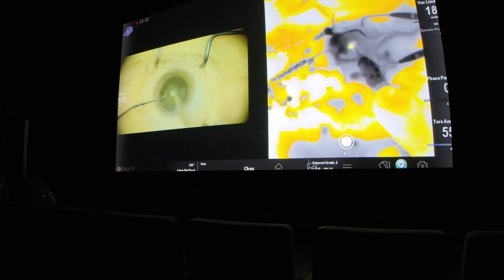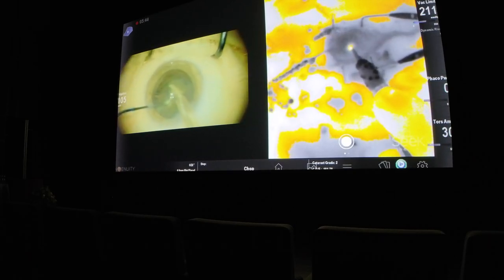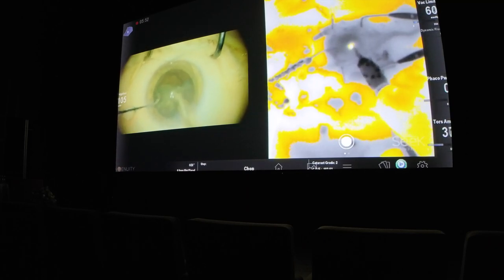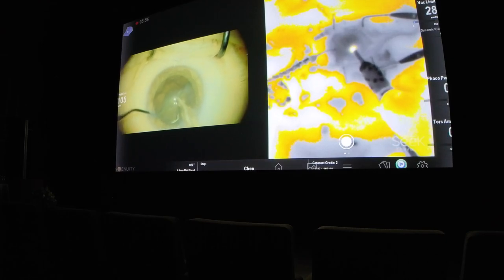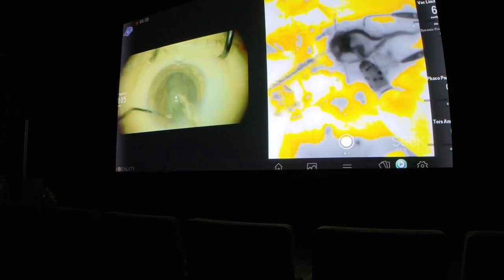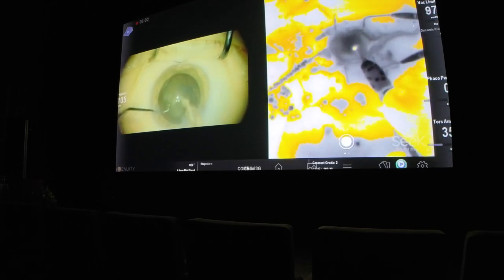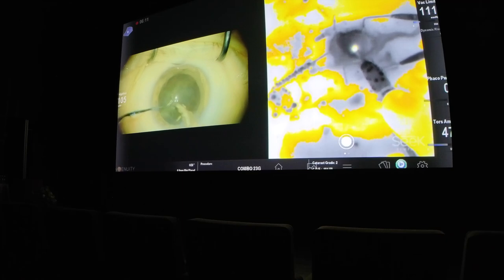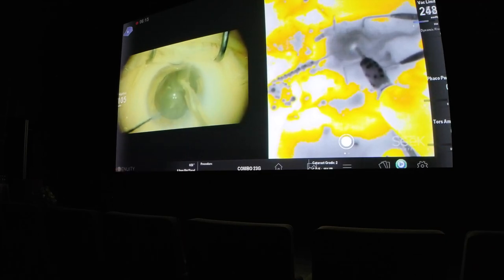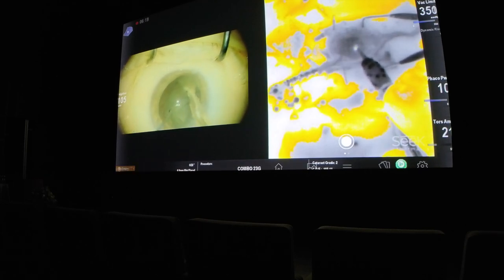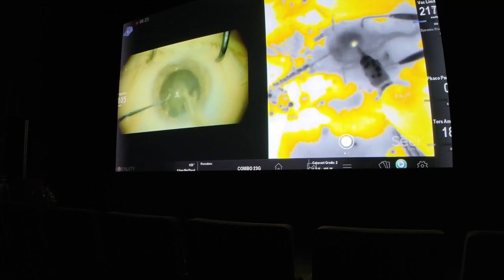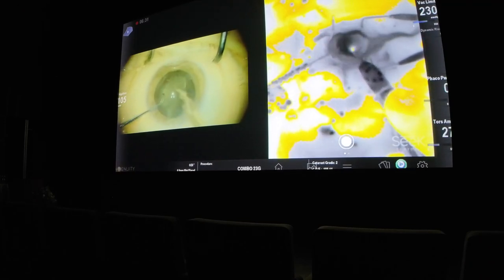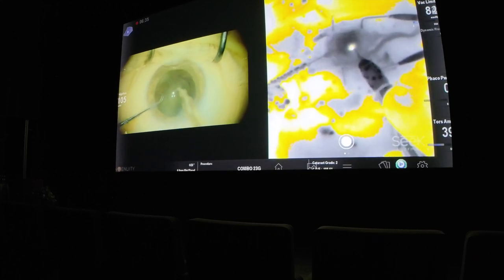This is another option showing how the picture-in-picture capability of Ingenuity might even increase our scientific research. On the right side of the image is a thermal camera attached to the Lumera microscope, and the image is simultaneously shown on the Ingenuity screen. We can titrate our power delivery by the color of the tip of the ultrasound — monitoring temperature in the anterior chamber during dense cataracts — and in that way determine our threshold for power delivery and save the cornea.